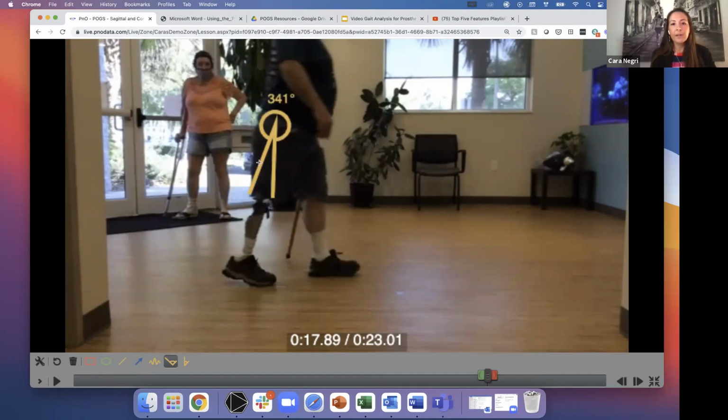And when I get that, I don't like it, so I go back and do the other angle. So he's right around 14, 15 degrees there.